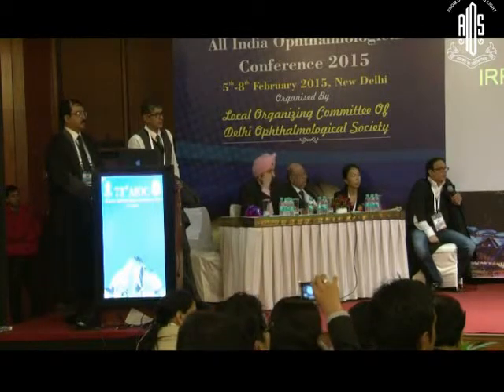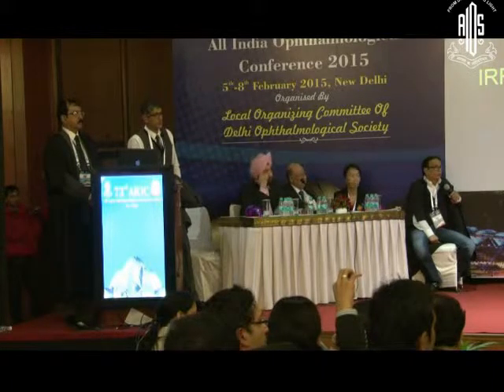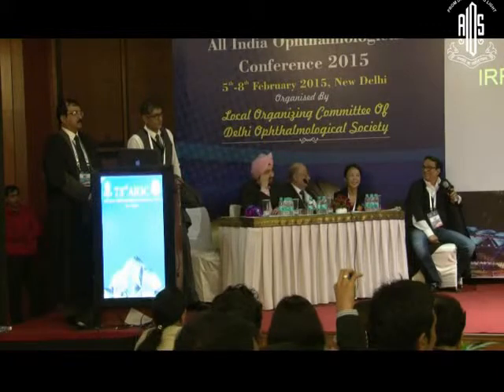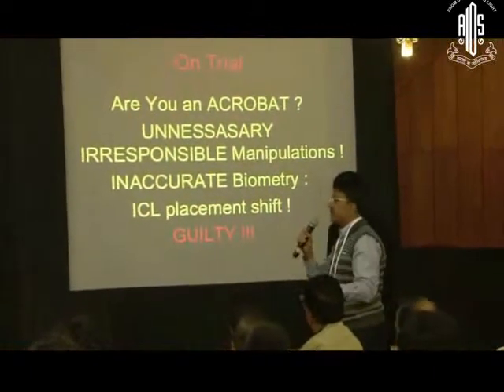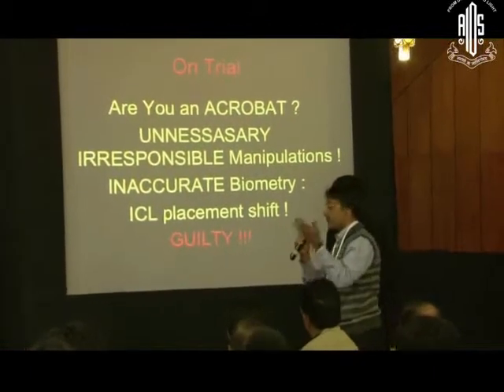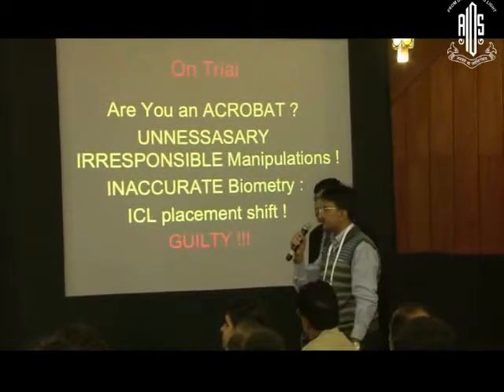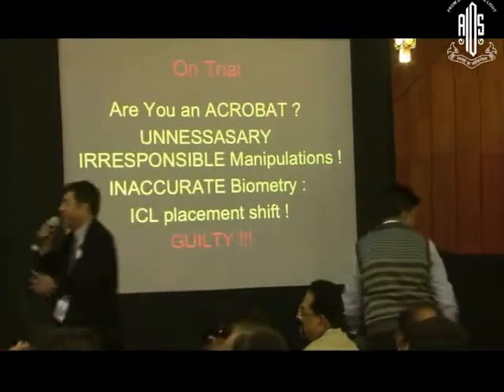Dr. Sri Ganesh, the IOL implanted was a monofocal IOL, so that patient lands up with presbyopia now. Instead, a monofocal implant with the highest possible plus diopter could have been implanted, and 6 weeks down the line, a multifocal Sulcoflex could have been implanted. So he would have got rid of all the problems. He still can do it. Sir, put one more lens inside. Put one more and then we'll show it in the OPL.